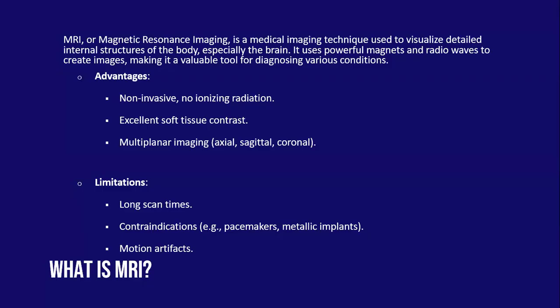We have implants that we've used in the brain, like to reconstruct the cranium. There are certain motion artifacts, especially depending on the quality of the MRI machine that you're using. So think of it like how you have your phone camera. You have a phone camera that's probably 8 megapixels. There's one that's 16, 32, so on and so forth. So same thing with the MRI machine. You would see there's 1.5 Tesla, there's 3 Tesla, and all this you're trying to be able to refine.